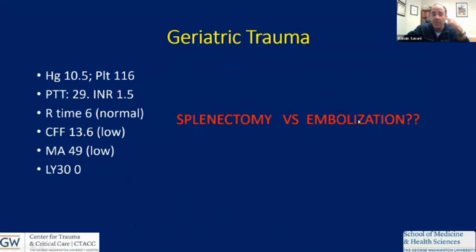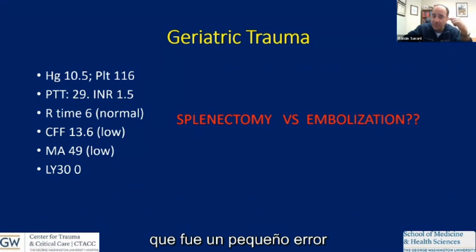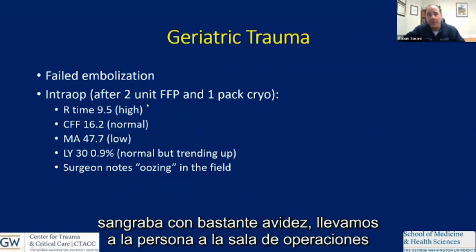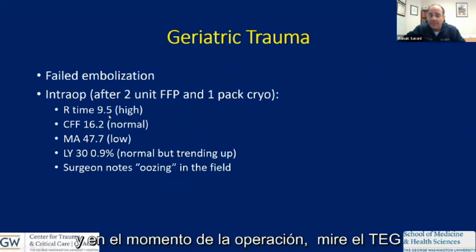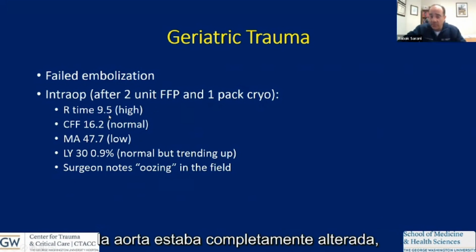I will tell you that at GW, one of the younger attending staff took this person for embolization, which I think was a little bit of a mistake. And that person then ended up failing in the morning, was bleeding quite avidly. We took the person to the operating room. And at the time of operation, now look at the TEG. The R time is completely altered.